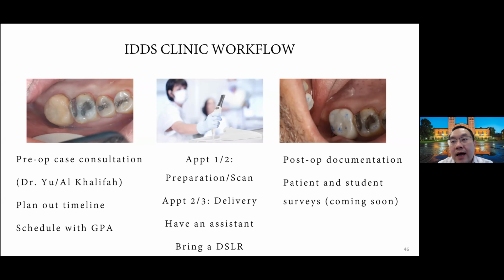After that, while you're preparing for the provisionalization, the faculty is going to do a tentative crown design to make sure that your crown is going to be okay. Sometimes we see the occlusal clearance is good, but when we actually design the crown, we realize it's a little bit short. So we design the crown tentatively, and the patient is able to see that too before they go. That's also the nice thing. We're going to mark the margins and send it to the lab, so the lab knows exactly where we want the margins.